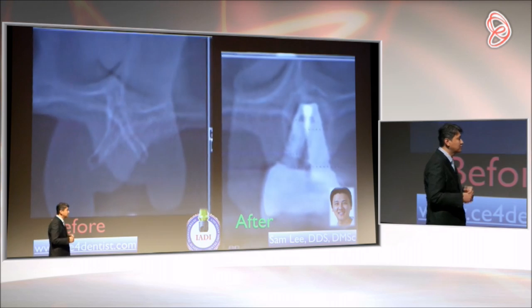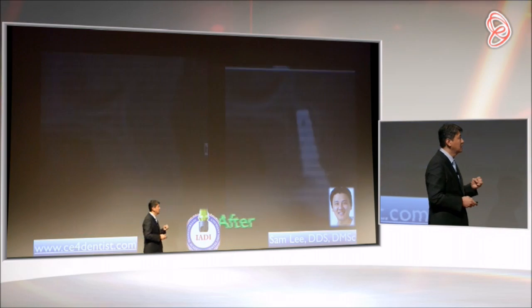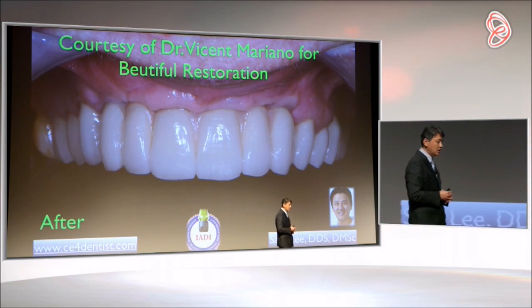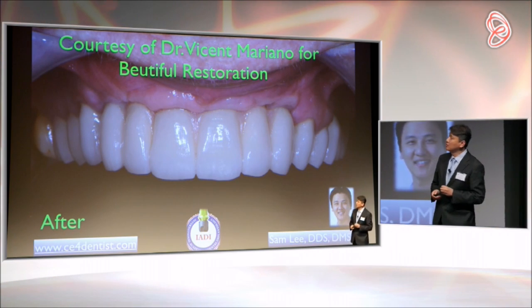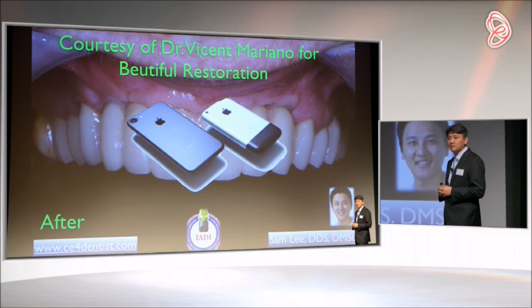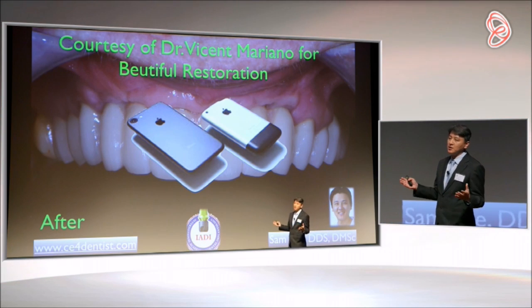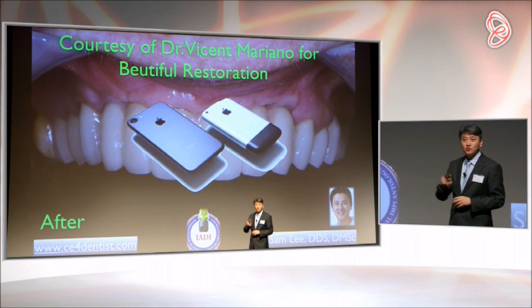So sponge bone has really changed the way I tackle the cases where we don't have any buccal plate, or we need to do horizontal or vertical ridge augmentation. And I'm very happy and lucky to work with many good restorative dentists in San Diego and Boston and in New York. But I believe this technique is still outdated. And my residents know that I don't use this procedure unless I have a very difficult case, because when we open big flap, there's more morbidity to our patient. So I think of this case as an iPhone 2.